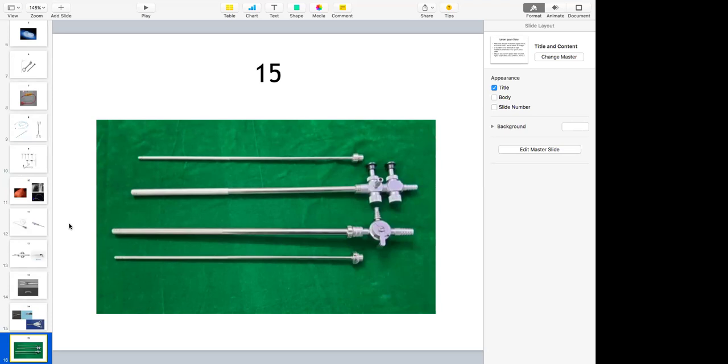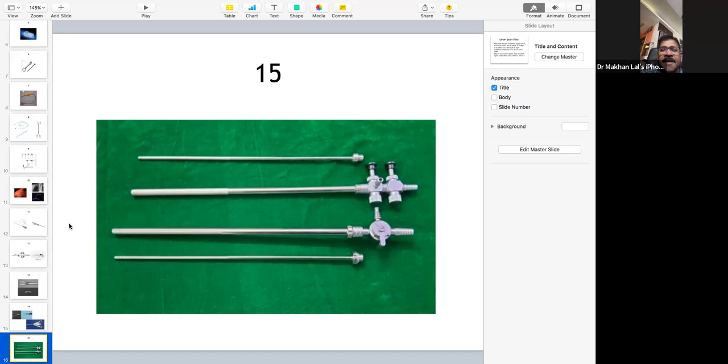Okay. So what is the diameter of the suction cannula? You can have both 5 millimeter and 10 millimeter. Mention one operation where specifically 10 mm is required. Laparoscopic drainage of liver abscess. Liver abscess will pass through any cannula. In hydatid, a wider cannula will be required. In hydatid, you need a wider cannula so that even the membrane can be sucked off.